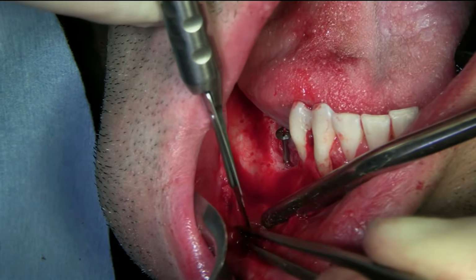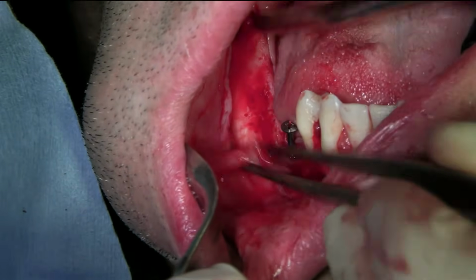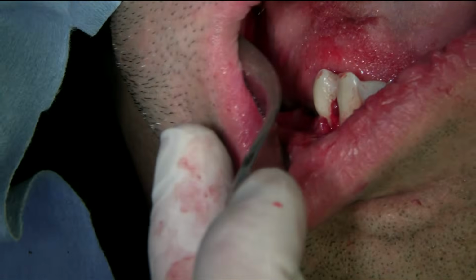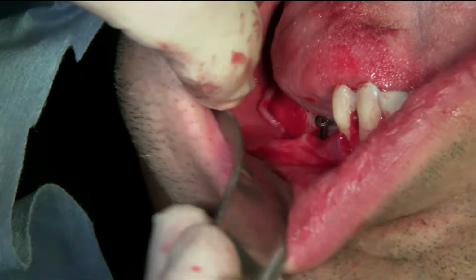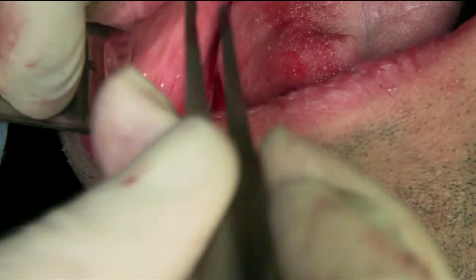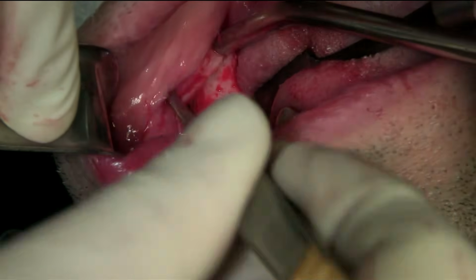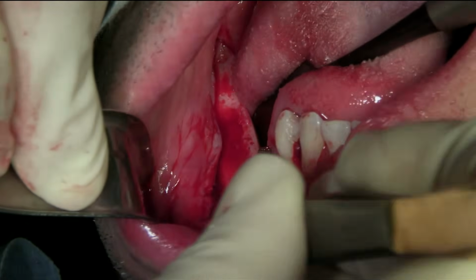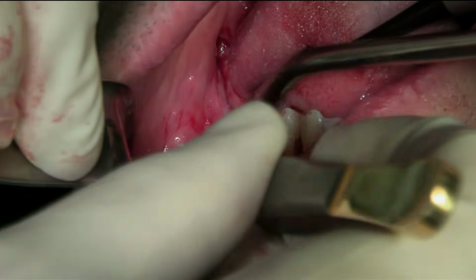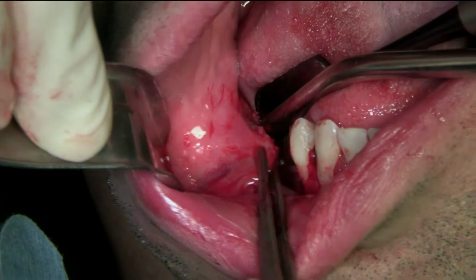Yep. Give me a little bit more anesthetic. Let's see how the flap is doing. We're going to check how the flap, retract the lingual, so I can see. I'll have this. So here's my buccal. Checking already how. Oh yeah. Look, the flap is completely loose.